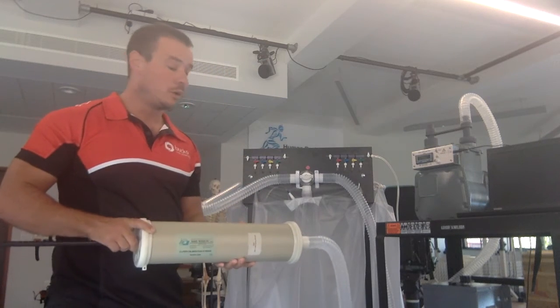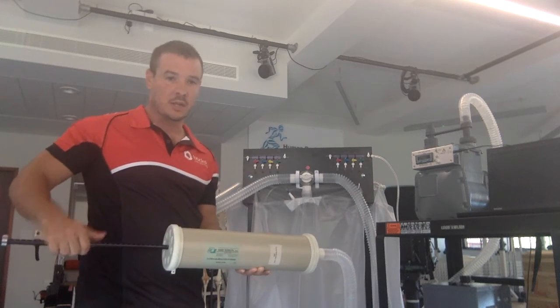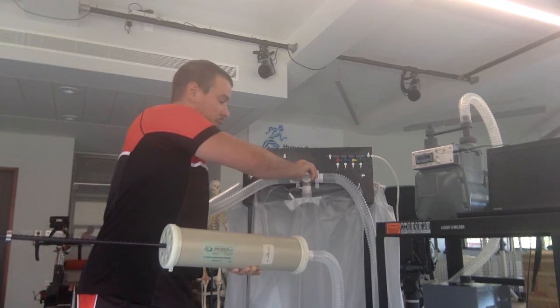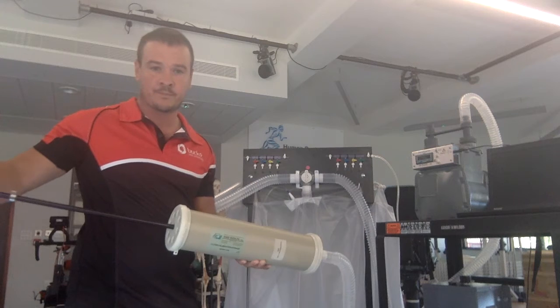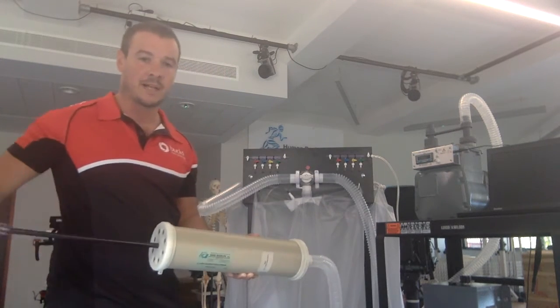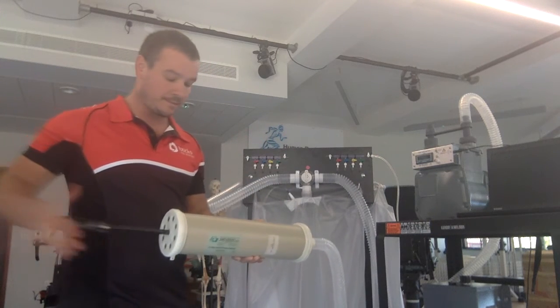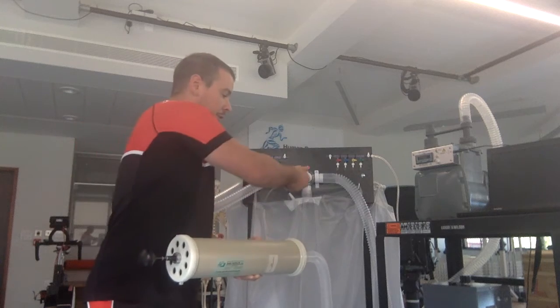Otherwise, you're withdrawing air back out of the bag. So now that the plunger is withdrawn, open the bag, pump three litres of air in there, seal the bag, open the syringe, open the bag and pump another three litres in.